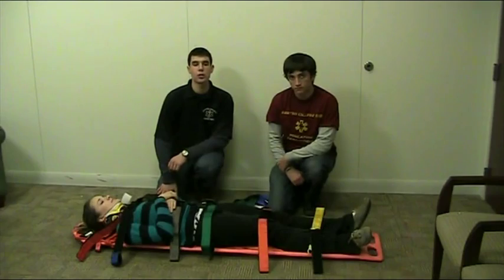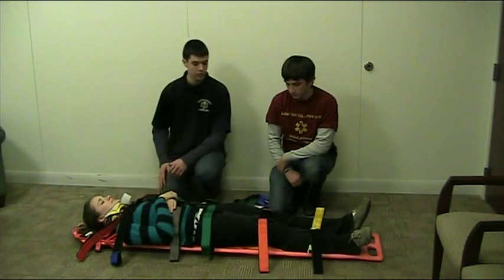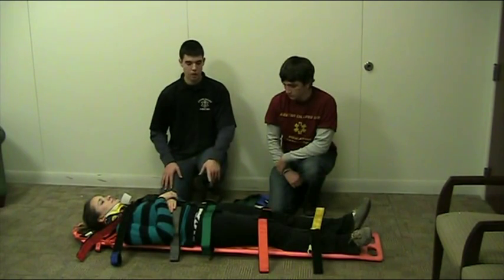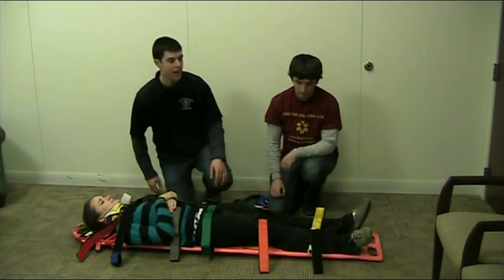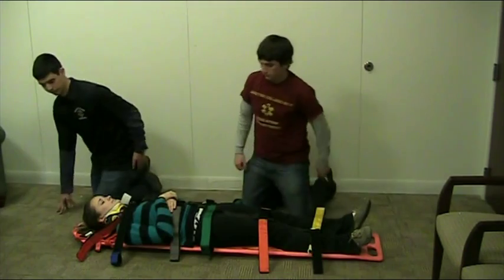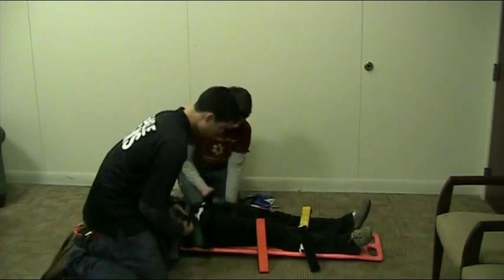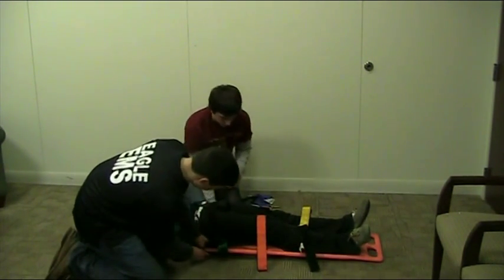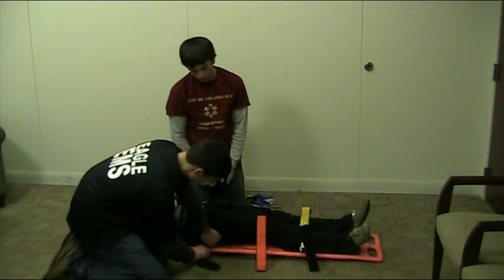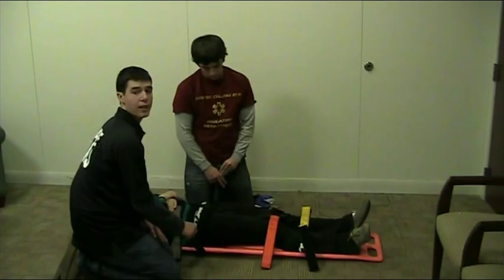There are several different straps that you can use to secure a patient to a backboard. In this case, we are going to use spider straps. We have the straps positioned along Kayla's body where they will be strapped in. There are some straps for the shoulders, one for the chest, one for the hip or pelvis, one above the knee at the thigh, and one below the knee. Kevin and I are going to demonstrate how to strap in the hip. To do so, you want to strap in as a unit. First, go through the hole of the backboard, making sure that the strap that's black in the middle of her body remains in the middle.